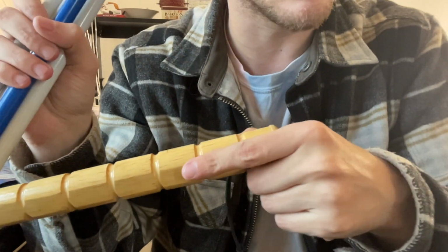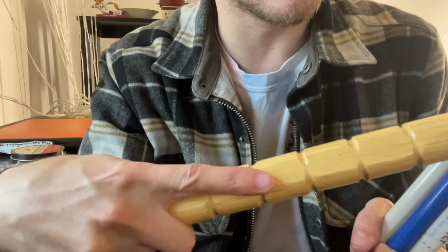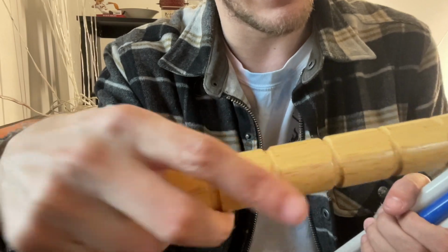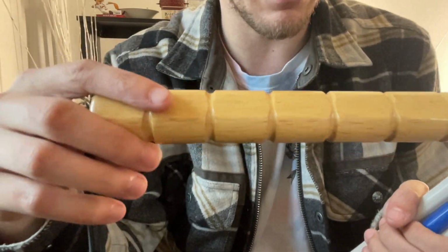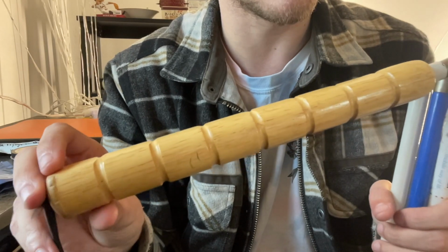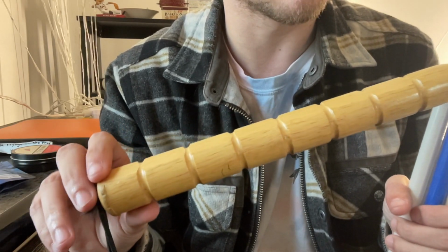And so you have your flat section, and that is used, I'm going to switch hands, for holding your finger along it as you guide the cane throughout your travels. So this wooden grip, I just thought it was a neat idea. In terms of practicality, it's not bad, but I'll touch on that when I talk more about the cane's design specifically.